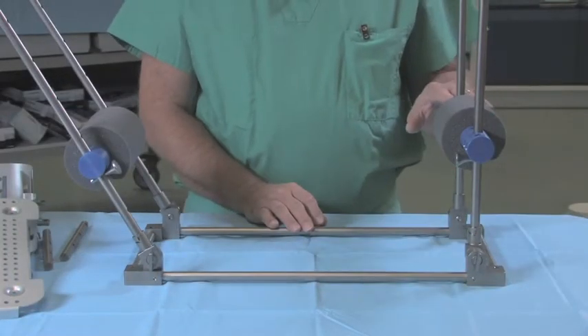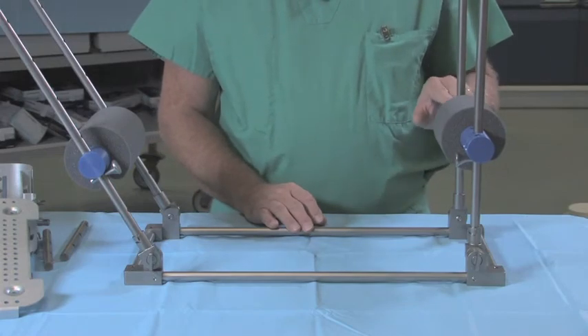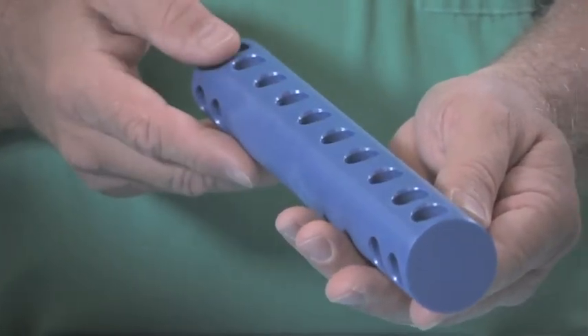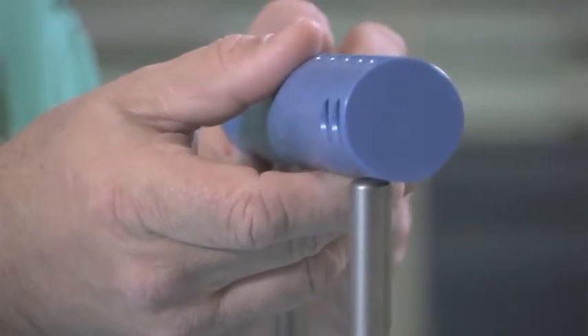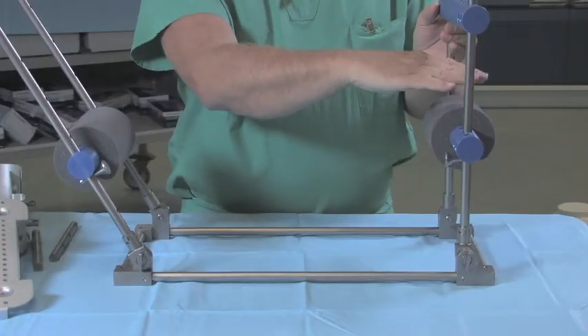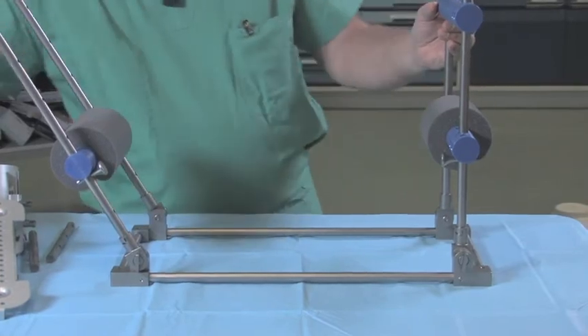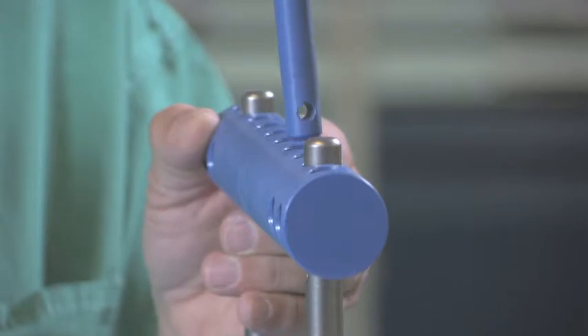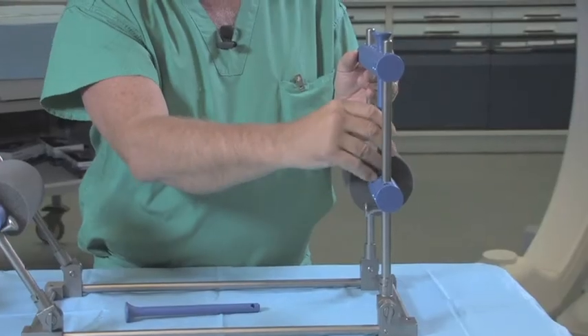Another addition that can be made to the distal part of the frame is the second multi-hole support bar. This is placed over the guideposts, so this would be on the dorsum of the foot. Then using these long blue T's, you can actually isolate the foot and ankle.